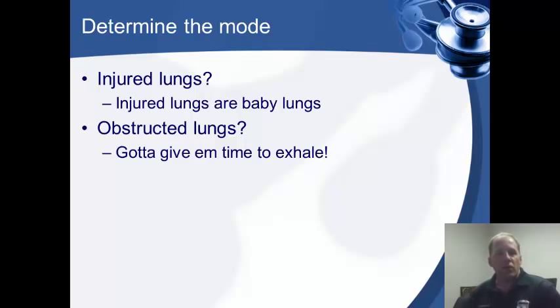Next, you want to determine the mode that you're in. So we're choosing either obstructed or injured lungs. Consider injured lungs as baby lungs. We want to take good care of them. We don't want to overventilate. And we want to make that setting to where we reach that capacity without exceeding it. Now, obstructed lungs, we want to give them time to exhale. That's our goal with COPD and asthma.